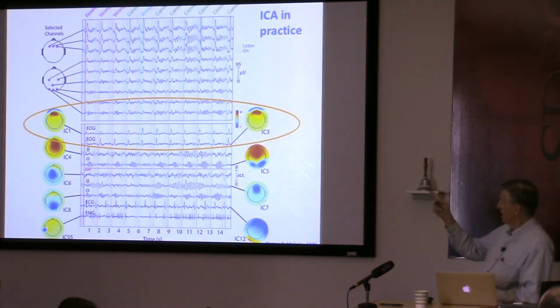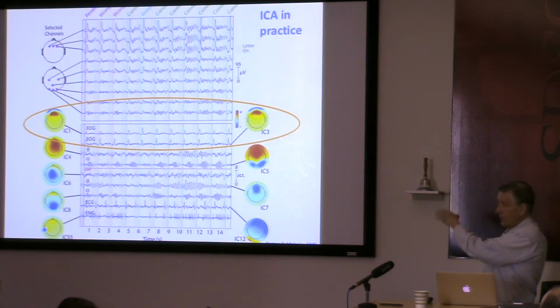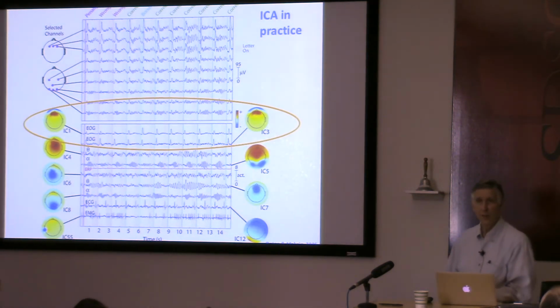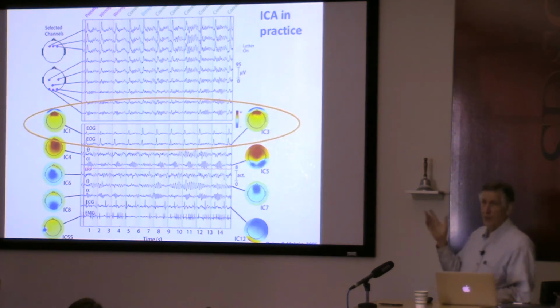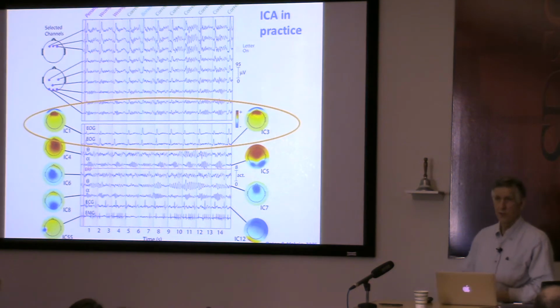Those signals are not independent of each other, but do you see any eye blinks in any of the other independent components? Any of the other ICs, we say? Well, you don't. You can't see any eye blinks in the other components. So what ICA has done is separated that dependent subspace away from all the other dependent subspaces.